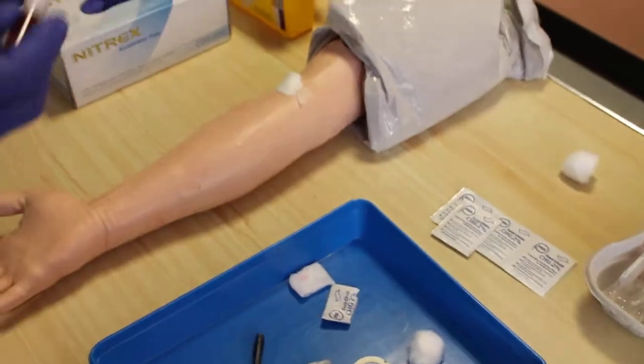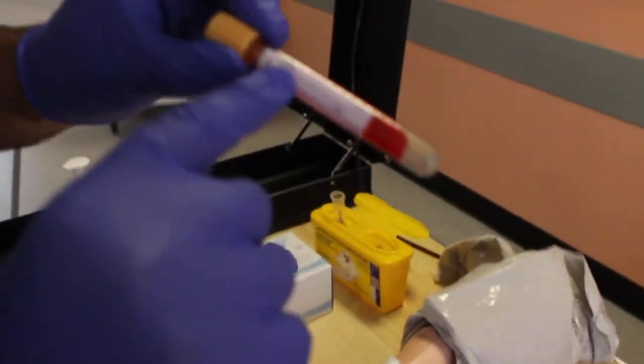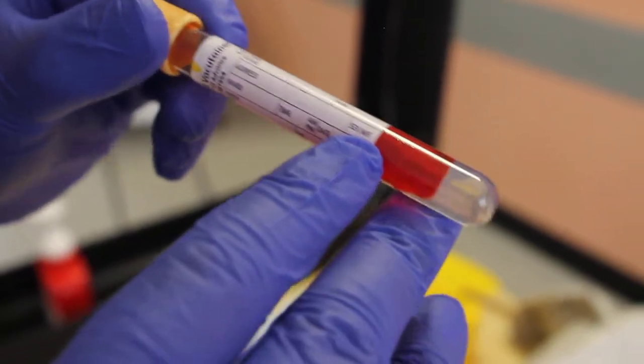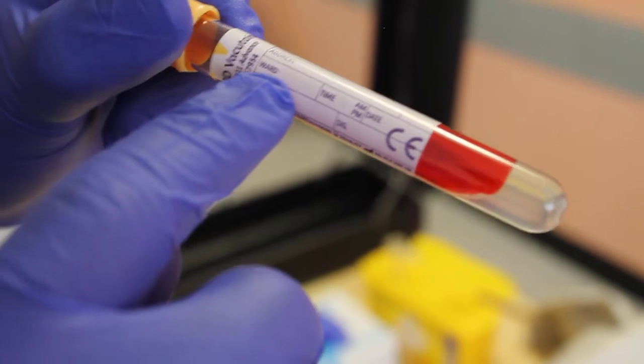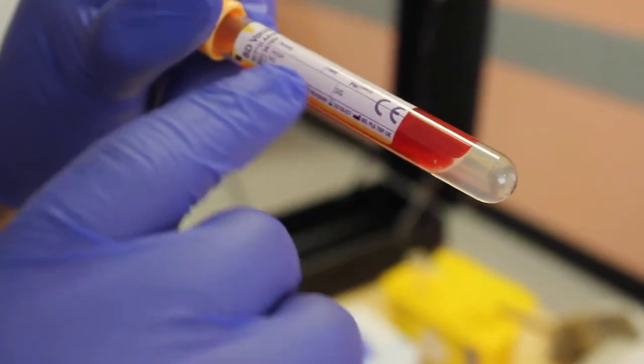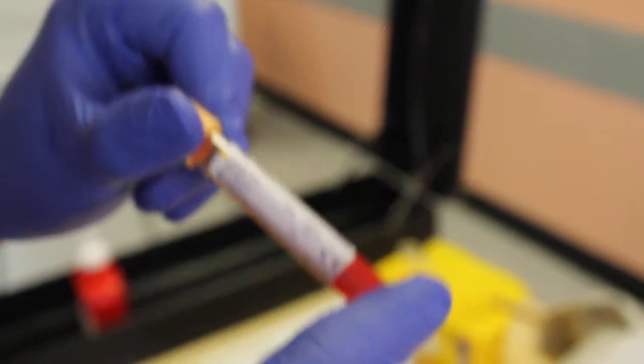After this, you need to label your bottle with the surname, forename, date of birth, address, whether they're male or female, which ward they're in, the time and date you've taken it, the hospital number, and sign the tube.